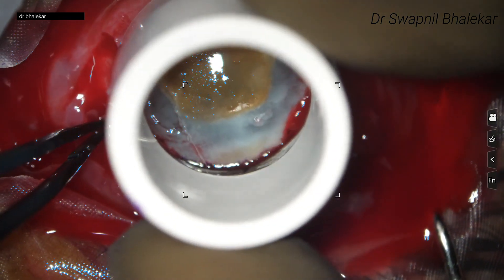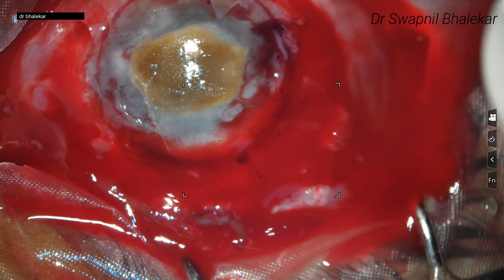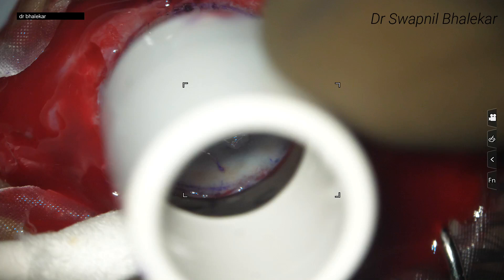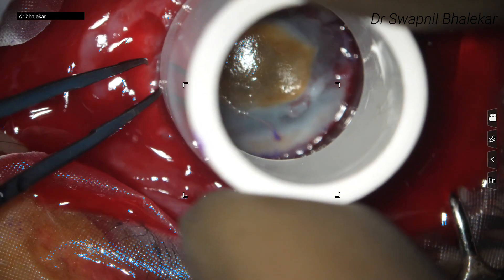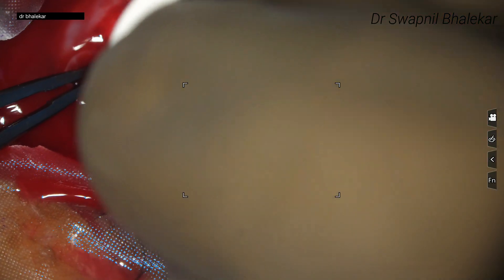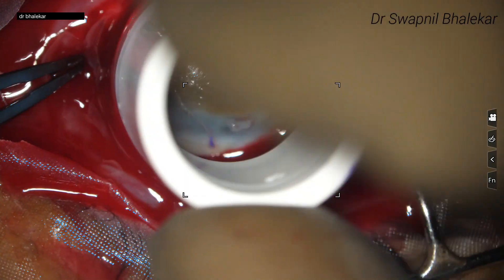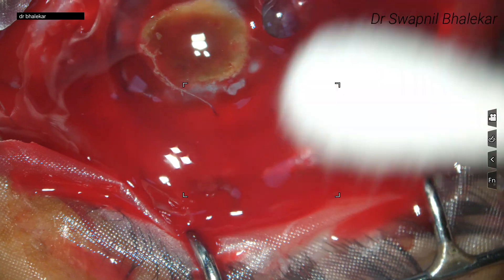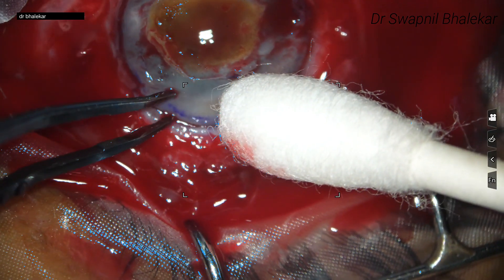Mark the trephine with a marker and place it at the recipient bed to check again if the size of the trephination is proper and adequate. Here we are using an 11 mm trephine to cut the recipient bed. You can notice we have marked the trephine with gentian violet marker so we can clearly see the trephination edges. This is especially important in this case because there is a lot of bleeding near the limbus. While using the trephine to cut, hold the eye steady with the limbal forceps. When rotating the trephine to cut the recipient area, make sure you apply even pressure all around to ensure that the depth of the cut is consistent.